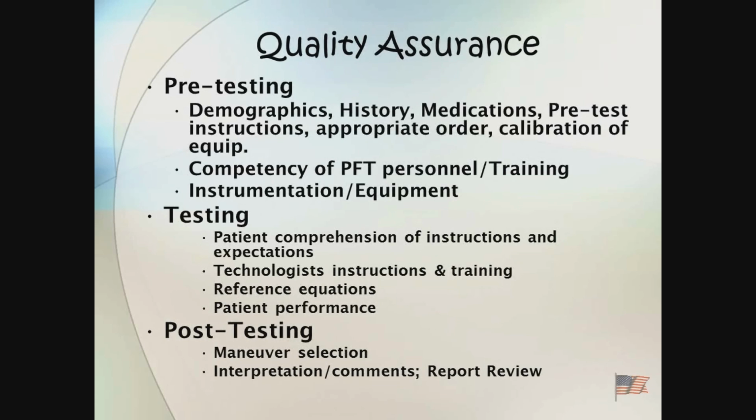Whoever is doing the testing should have some prior training in pulmonary function. This is one of my pet peeves with medical assistants in physicians' offices. They often have very minimal training in pulmonary function, and a lot of the small handheld spirometers give grades and say this is a good test or this is a bad test. Unfortunately, what a lot of physicians' offices do is turn those off, defeating the entire purpose. So take that as it is.